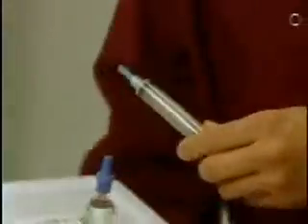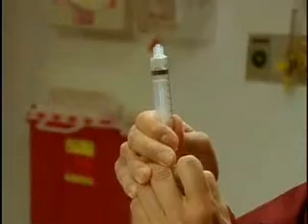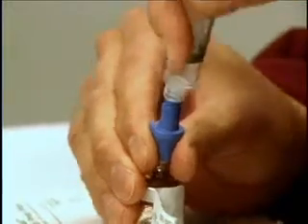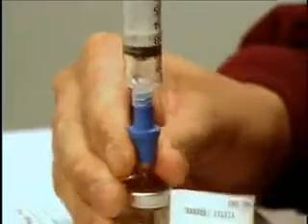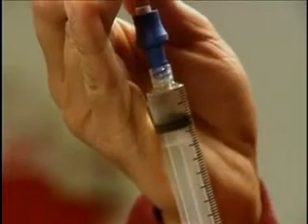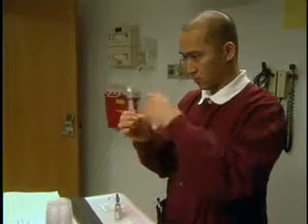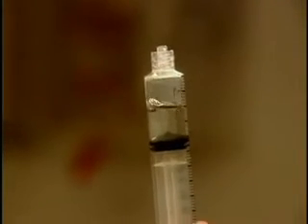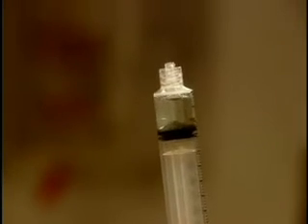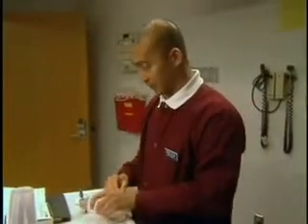Okay. Okay. I'm ready. And then what? And I rechecked the label against the MAR.